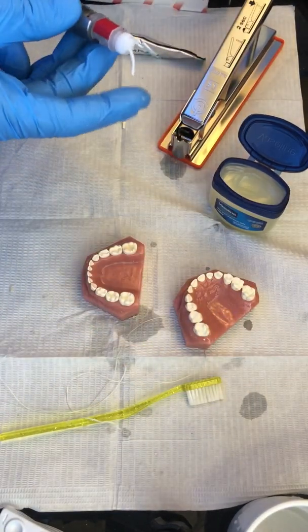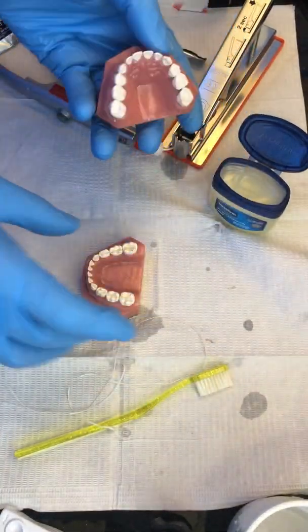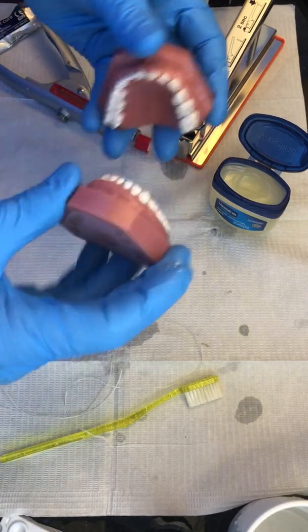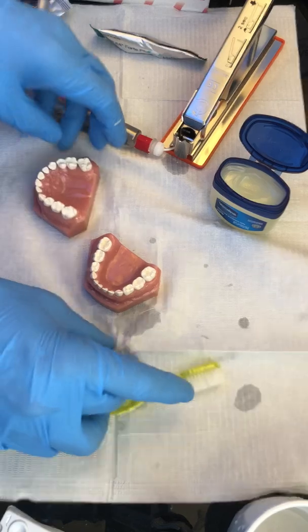Adding a little bit more material and continuing to push on. Now we're going to have the patient articulate and grind around a little, then we're going to floss.